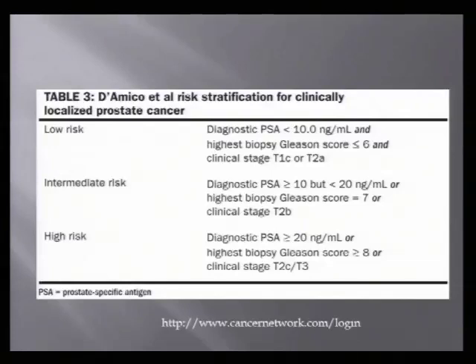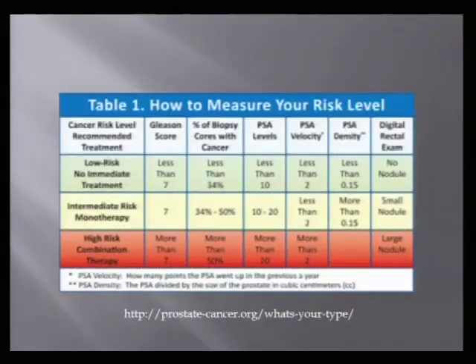And you can see right there using PSA, Gleason score, and then the clinical stage, which is where, in general, people think that prostate MRI might be helpful, with the staging. But I'll show you. And I talked to Brad about this in one of our meetings. I actually think some of its usefulness is not really so much the staging, but other things that you won't even see in slides like this. And I'll show you examples of that.